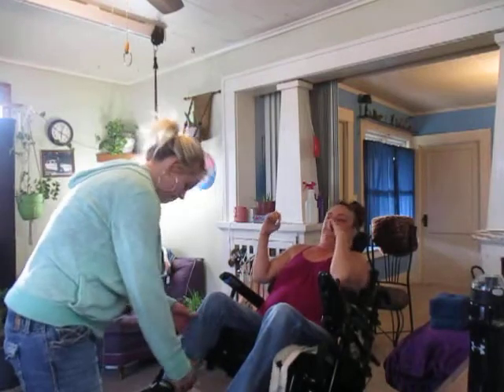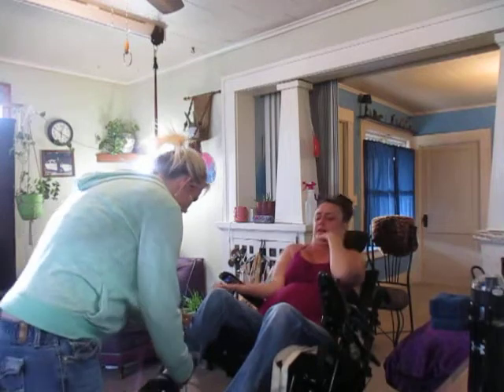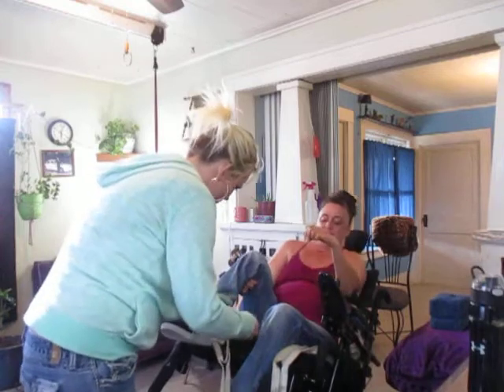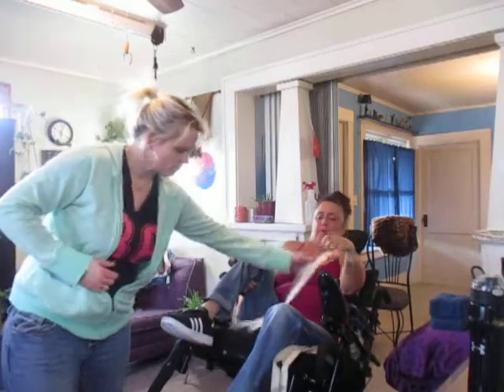You can unbuckle me. I'm going to put on my comfort companion — I think that's what it's called. I call it a foot box. And then I'll have them pull it through in the center, press into the cushion, and pull it through another inch, because then it's really around my butt bone.